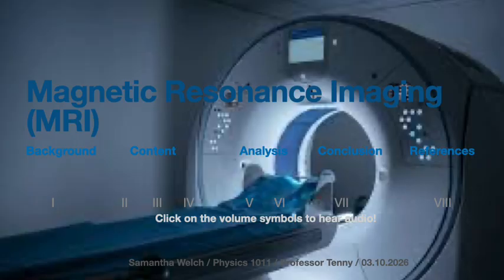Many atomic nuclei behave like tiny magnets. This is due to a property called spin. Spin is a quantum mechanical property of protons. Hydrogen atoms are very important for the MRI because a human body is made largely of water, and each water molecule contains two hydrogen atoms. The hydrogen nuclei contain one proton, and this proton behaves like a tiny magnet because of the spin property.